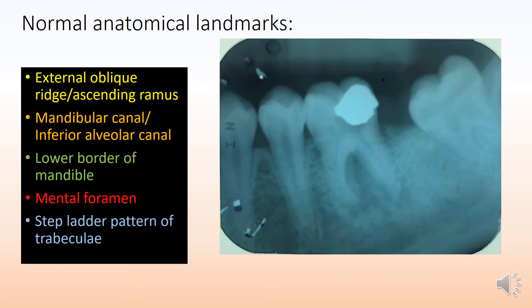The normal anatomical landmarks you would generally see in a mandibular molar region include the external oblique ridge, also called the ascending ramus, pointed out by the yellow line, followed by the mandibular canal, also called the inferior alveolar canal, with its location pointed out by the orange line.